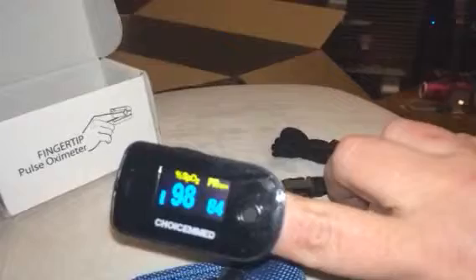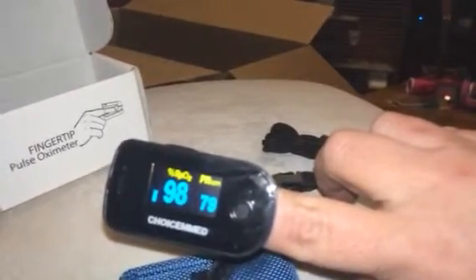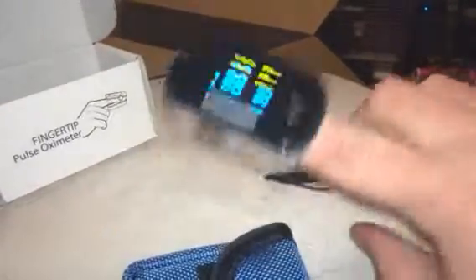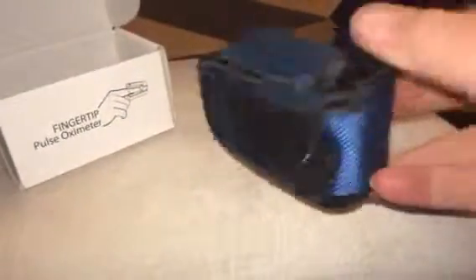Then it comes up and tells you your percentage of oxygen and your pulse. It reads that for you. It comes with a lanyard so you can easily carry it around your neck, and it also comes with a little carrying case, which is nice.